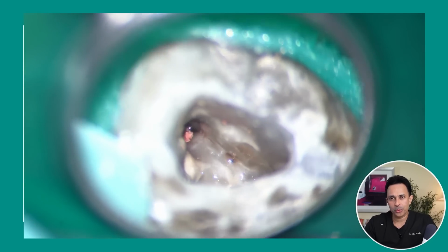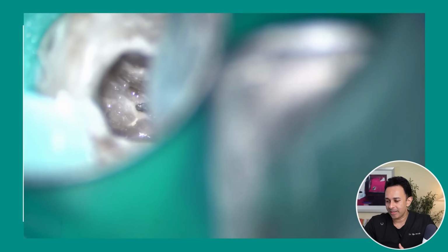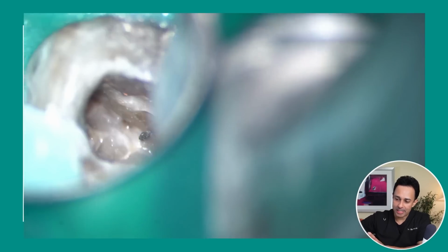So as far as I am concerned, I prefer a burr to an ultrasonics unless the access is a big problem. Okay. So the needle burr, very important tool. This video shows you how we use a needle burr. You can see here you have a missed MB2 there, and then you take that burr and then move the whole wall mesially using the burr.